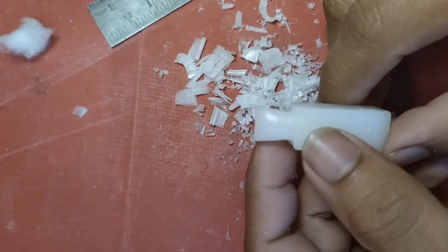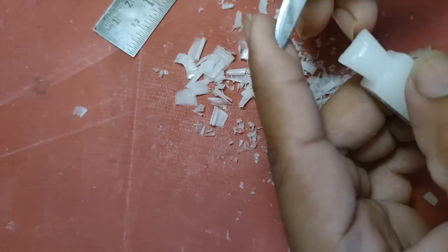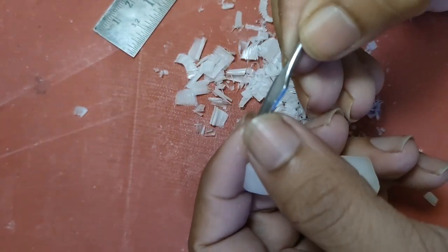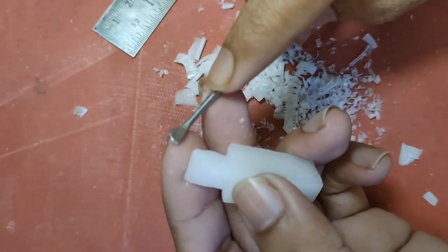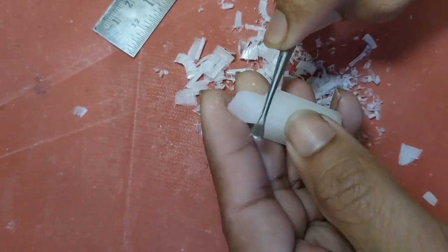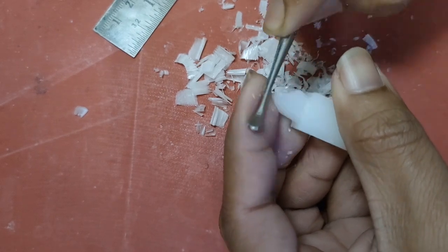Now we're done with the crown. So we can polish it now. For that, use the blunt edge of the carver, give some strokes like this, or you can also use this round portion in this way. We'll be smoothing off the edges a little.